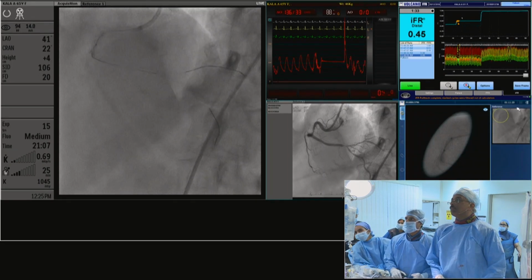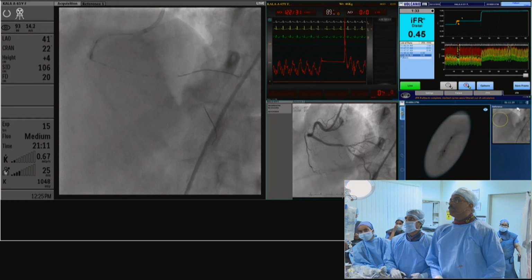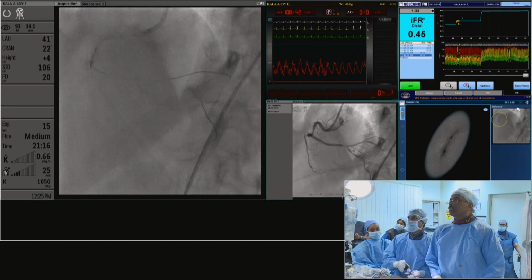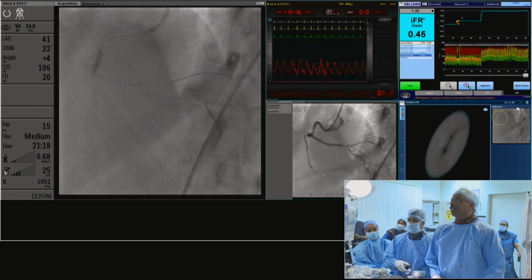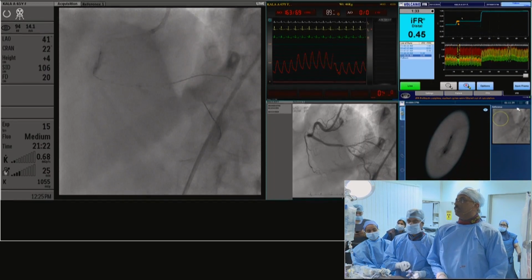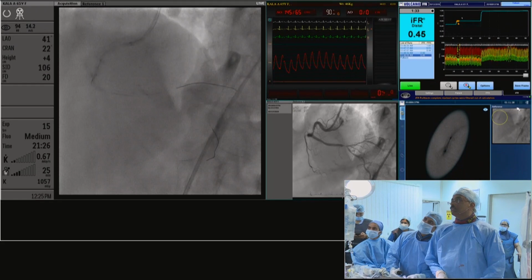It hasn't got sharp blades, and that's the specific reason for it. They believe that the efficacy can go down. As you know, it's a non-compliant balloon on the side, a high pressure balloon: 10, it takes 12, high pressures, 14, 16, but it expands also. So that's the only reason why they recommend it. But there's no big deal, there's nothing wrong with doing it.